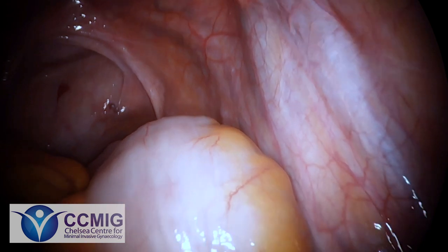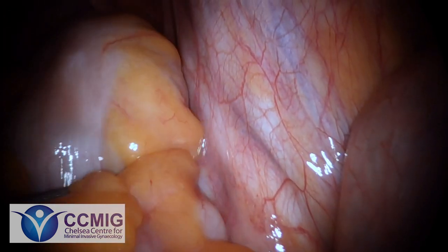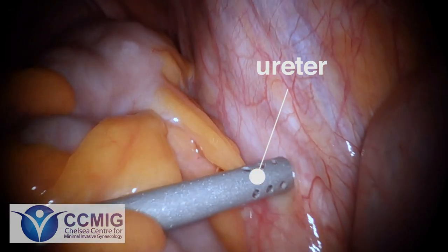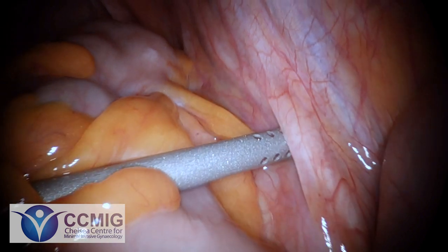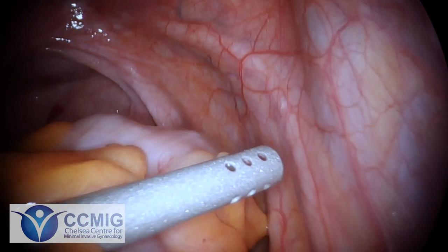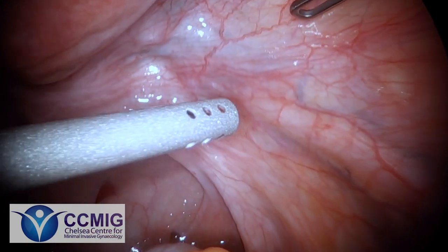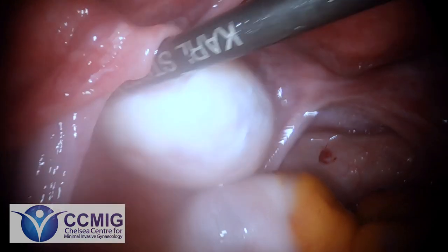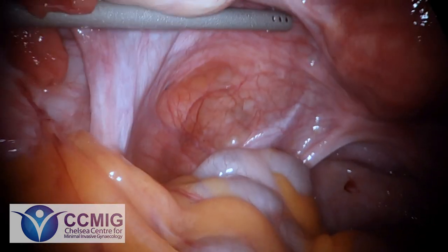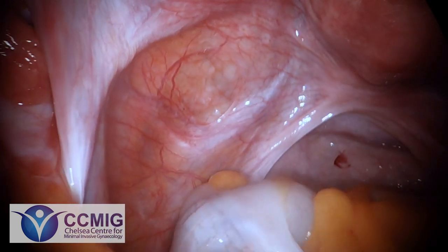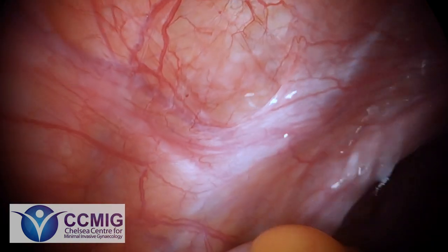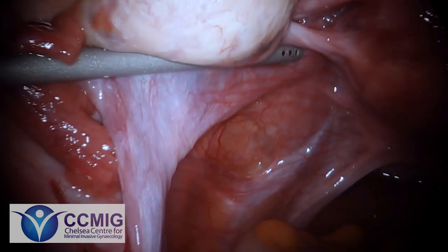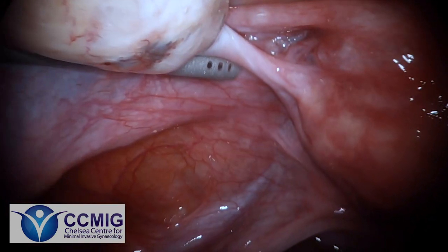Here we're going to take a close look at what we call the ureter. This is the tube that moves from the kidney all the way down to the bladder and it carries urine along its course. It lives fairly close to the gynaecological organs — things like the ovary and the womb — so it can be exposed to damage as part of a lot of gynaecological procedures including a hysterectomy. Endometriosis also likes to live fairly close to this, so it can be quite difficult to dissect. Here we have the same view on the left hand side — an ovary at the top, looking down at the peritoneum. You can see endometriosis here that looks slightly different — this is a whiter variety of endometriosis. It's funny to think how these relatively small lesions can actually cause such significant pain and difficulties. Here we find endometriosis on the ovary.